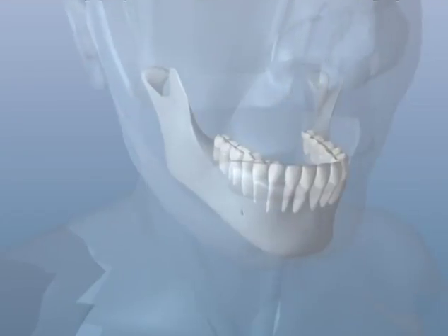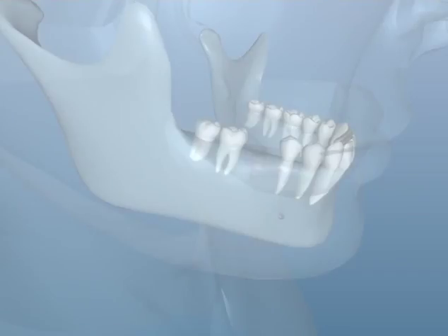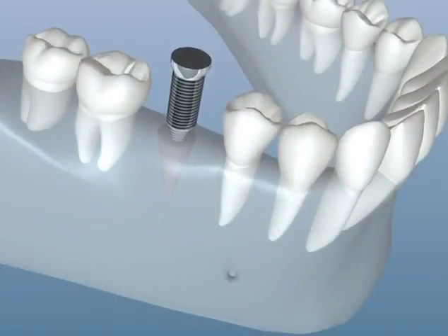During the initial surgery, the oral surgeon places the implants in the patient's jawbone. This is the more involved and longer of the two procedures. During this surgery, the oral surgeon makes an incision, then creates a precision hole, places the implant in the jawbone, and then closes the incision with sutures.